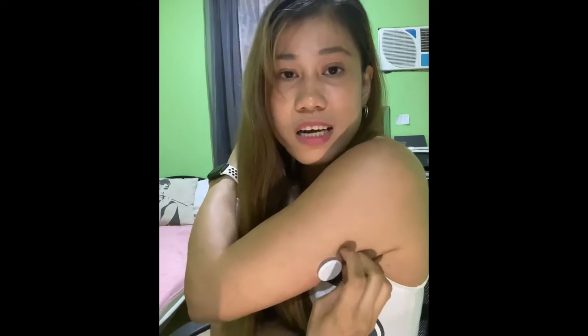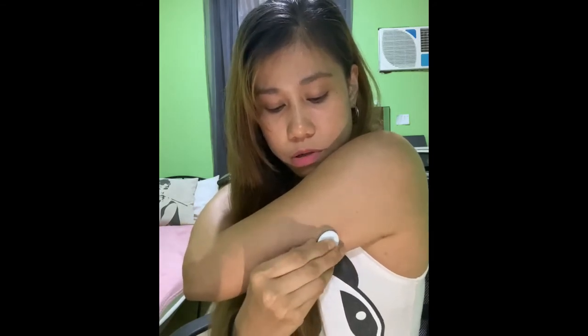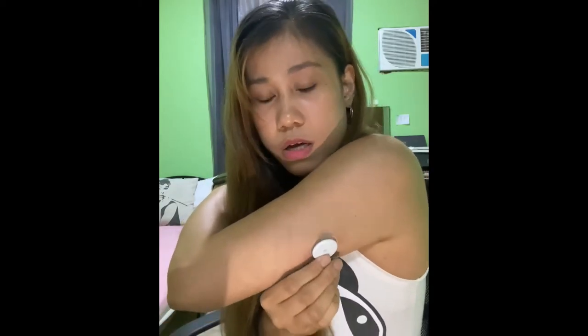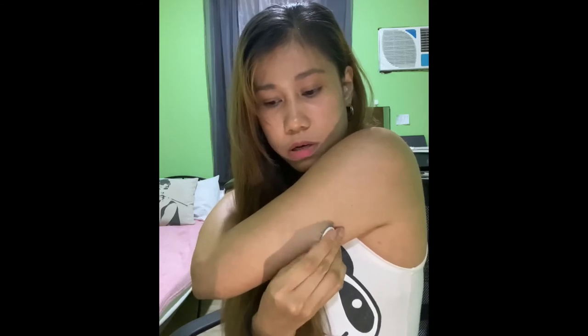Actually, it bumped into a doorframe once, but it still didn't come off. Most people in the US use a patch to make it stick more firmly because usually it doesn't last them 14 days — it comes off on them. But for me, even my first sensor, even when I worked out and sweated a lot, it still stayed on.